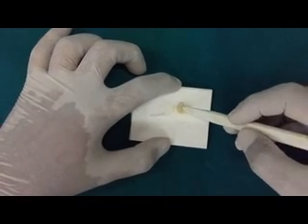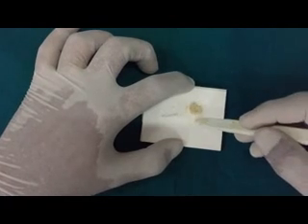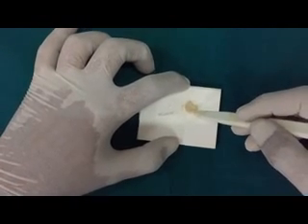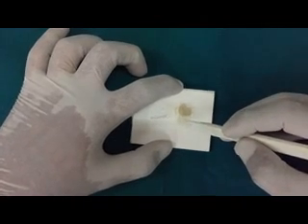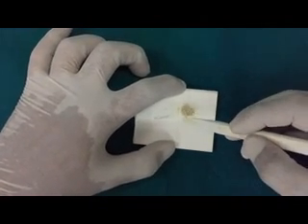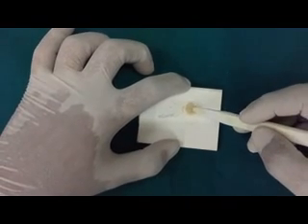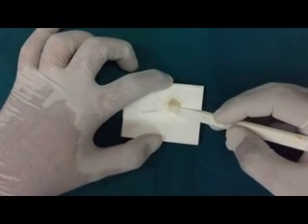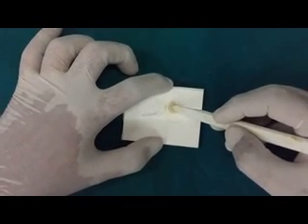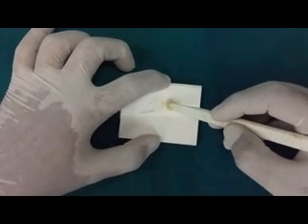We do not allow any kind of water contamination or water loss from the restorative material. Once the restoration has been placed into the cavity it is coated with a water impermeable film using petroleum jelly or cocoa butter. This prevents the saliva contaminating the restorative material. At the same time water from the set mass does not get desiccated.